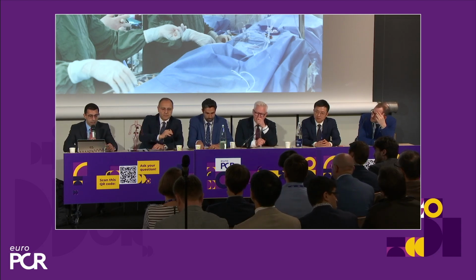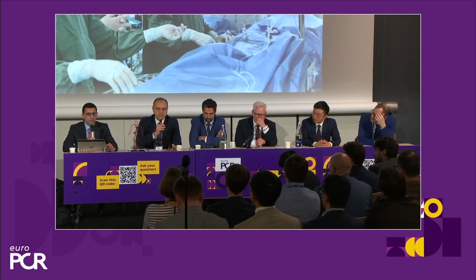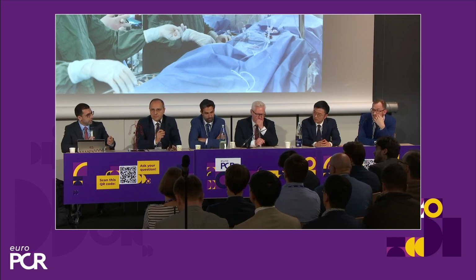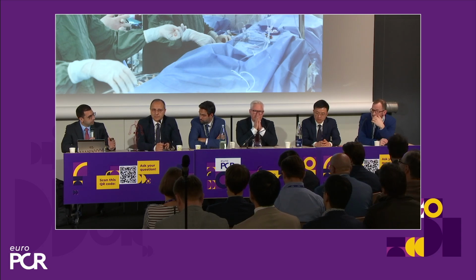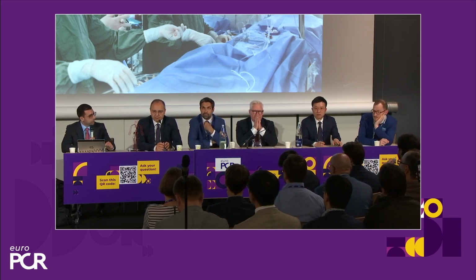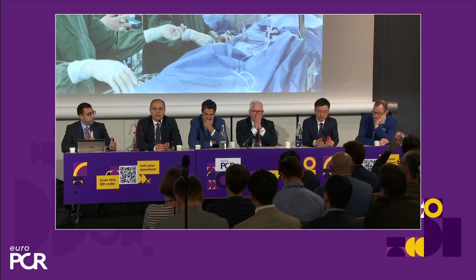Yeah, so we got a very interesting question from the audience. As we say that it's so easy to go in and out that you may have the pullback. Sometimes you also have diffuse disease, which means that the gradient is coming up very slowly. So what is your opinion about the treatment? Should it be stented partially?